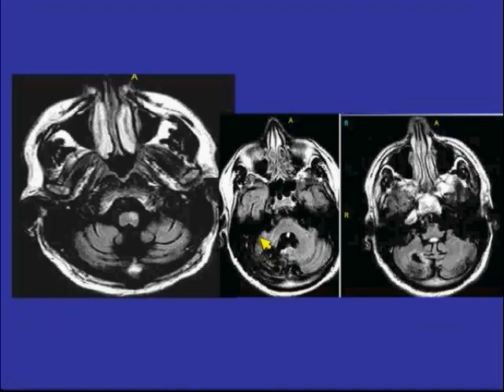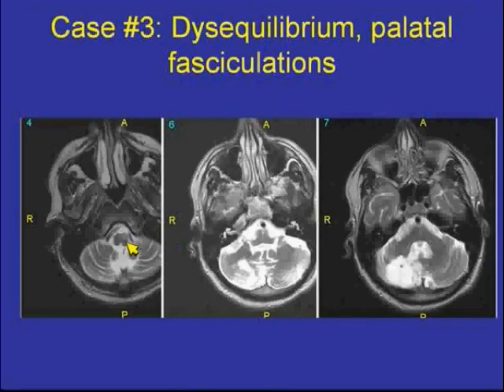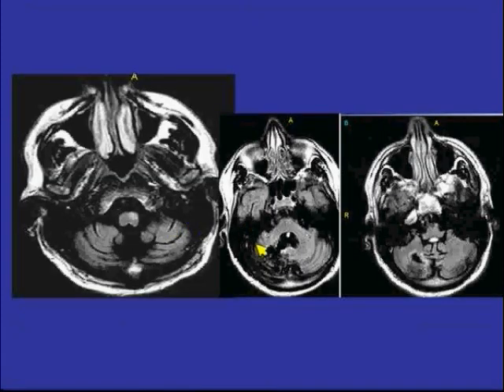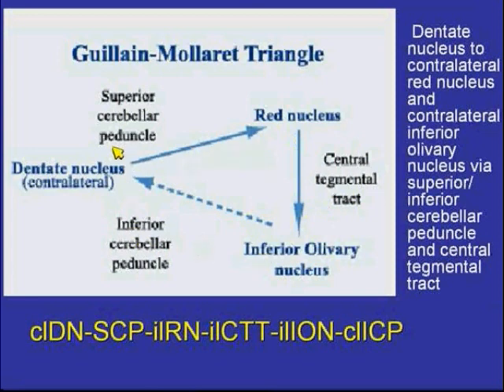What one sees here is the high signal intensity in the medullary olive with enlargement of the olive, which may be better seen on the T2-weighted scan. This is due to injury of the dentate nucleus. Looking at the Guillain-Molaret triangle, there are connections between the red nucleus, the inferior olivary nucleus, and the dentate nucleus, mediated through the ipsilateral central tegmental tract and then across via the contralateral superior or inferior cerebellar peduncles.